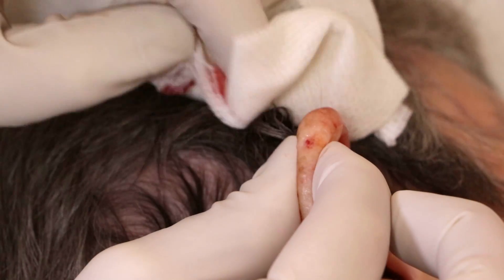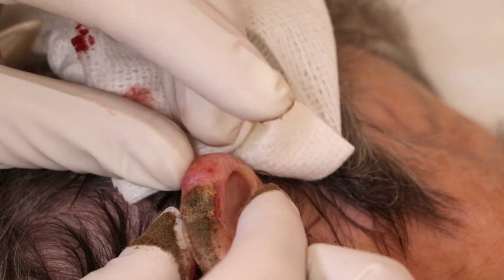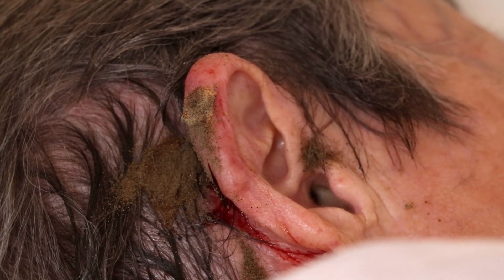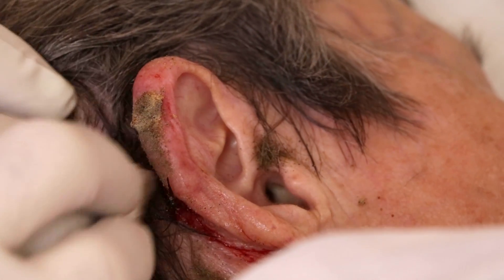Between my fingers is where the wound seal goes — just pour it on, all at once. I'm going to take my fingers off now and we will see what we have. We have some wound seal there. I'm going to just kind of get that off of your head.